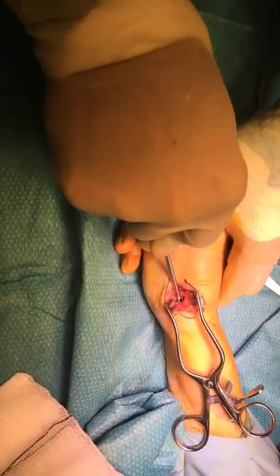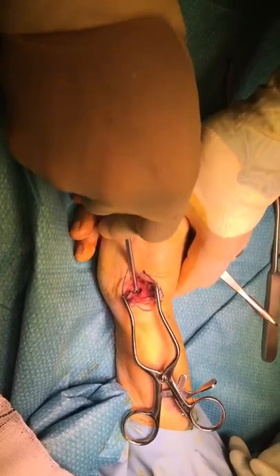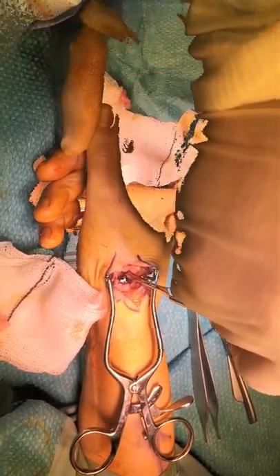The trapezium is exposed and is then reamed using the appropriate reamer, usually to size 9, and the trial cup is applied.